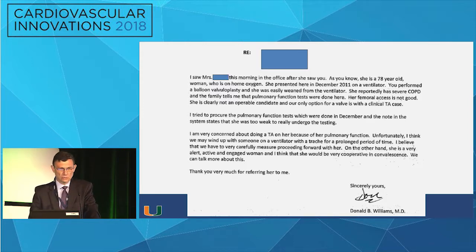We were, I think, one of the first sites doing TAVRs in Florida, there with Bill O'Neill. And I had an old video from KBM on how he did the first TAVR, so he had all the steps in that video, and I had a Bill that had done the first transseptal antegrade TAVRs in the country, with some of the results that I showed with laceration of the mitral leaflet.